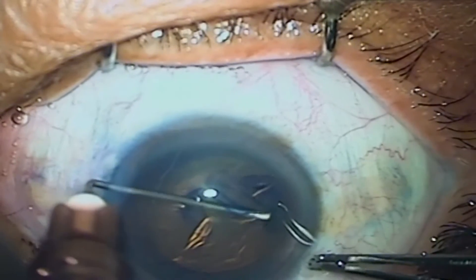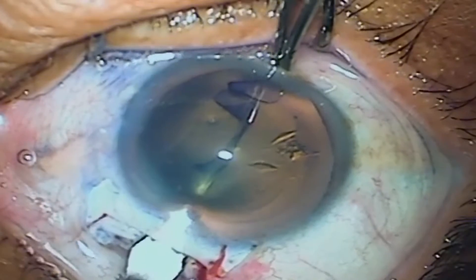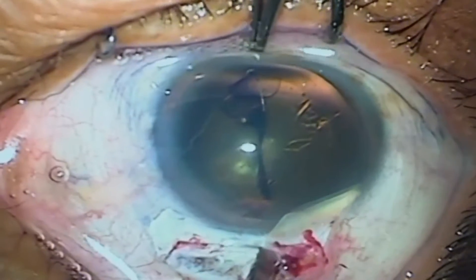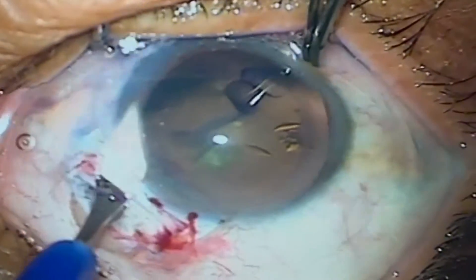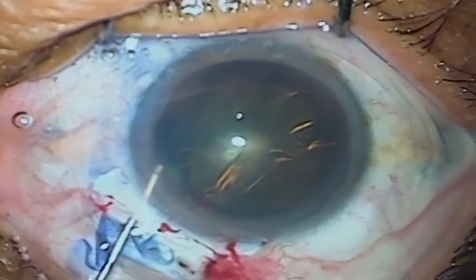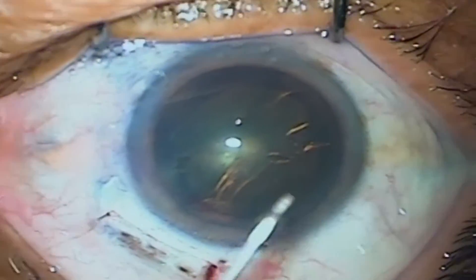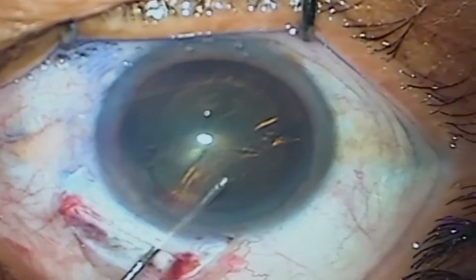Most importantly, surgeons have always complained that post-operative reaction is more after manual SICS. The main reason we have found is injury to the iris, especially the part under the incision by the instruments. Under no circumstances should your instruments touch the iris under the incision. In phaco emulsification with clear corneal incisions, the angle of the phaco handpiece is such that it doesn't disturb the iris on its way.